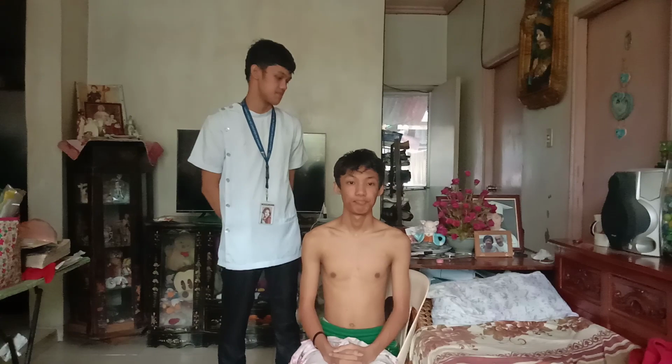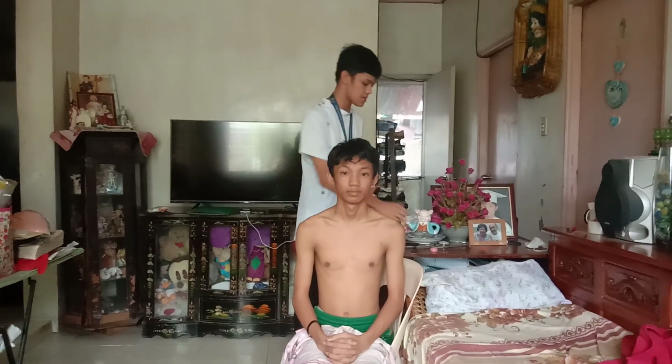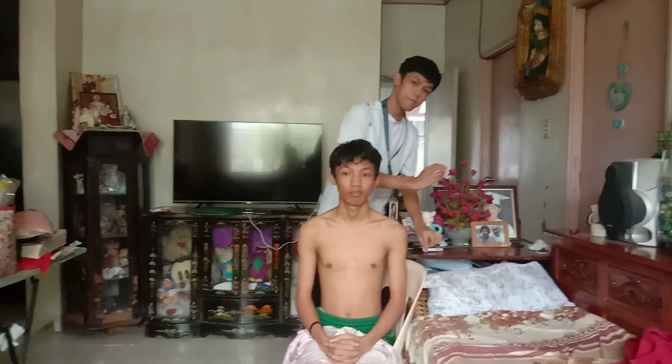Good morning, sir. I am J.M. Perez, and I'm here to perform an assessment of the chest and lungs of the patient. First, I need to assemble all of my equipment, which is a stethoscope, skin marking pen, and tape measure. After assembling all of my equipment, I need to read the patient's chart to provide baseline data.